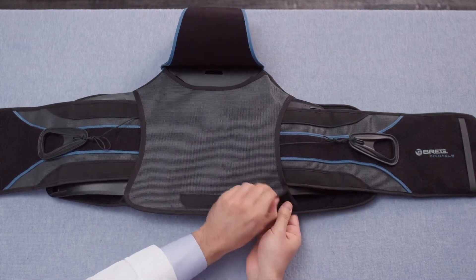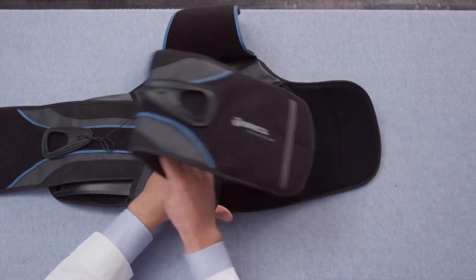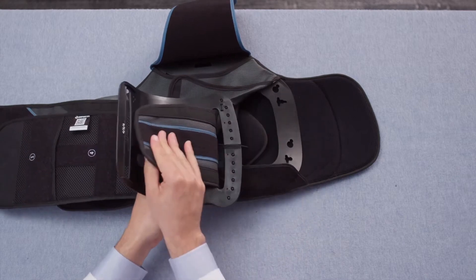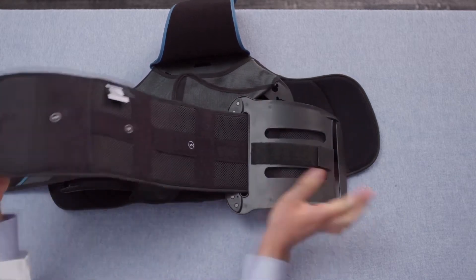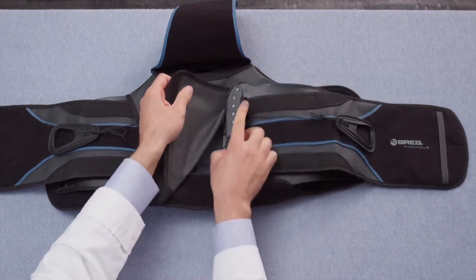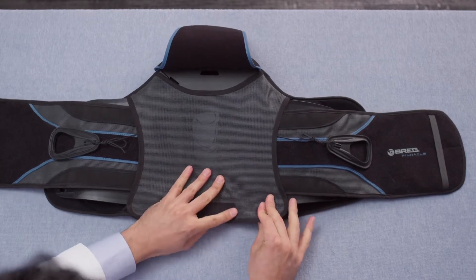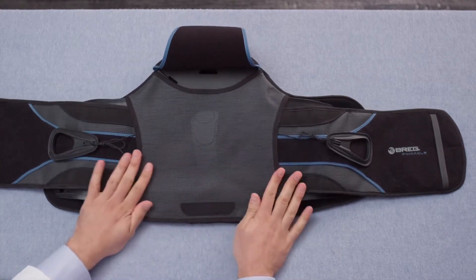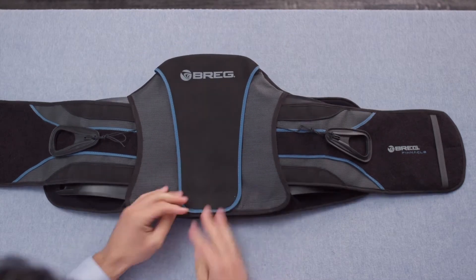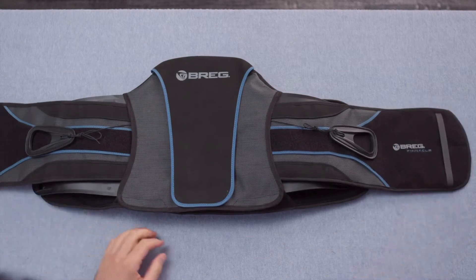Repeat those steps on the other side in the exact same way as the first belt panel. Again, ensure that the back cover is pulled tightly as you engage the hook and loop at the bottom corner of the back cover. The final step before fitting the product on the patient is to pull both sides out equally to center the lacer system.